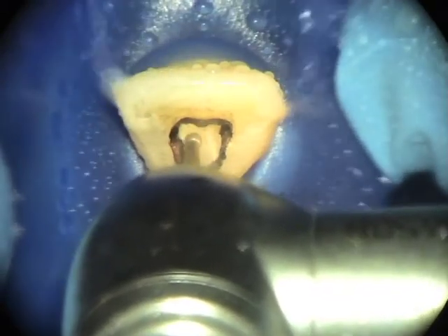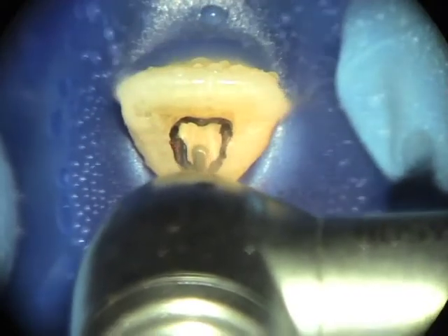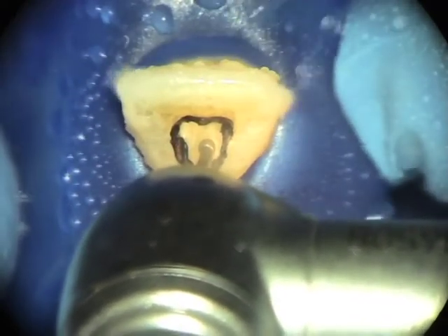The cavity is made by gentle brushing over the pulp chamber until its roof is penetrated.